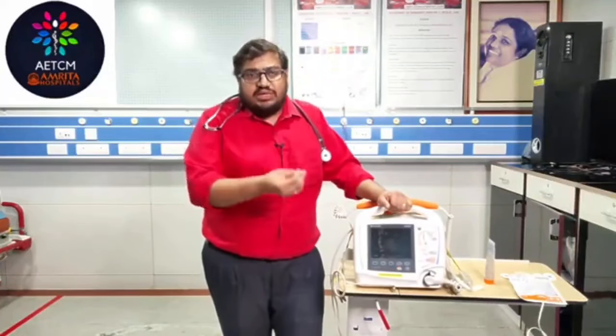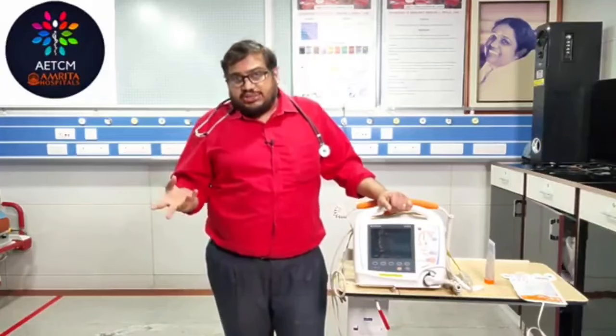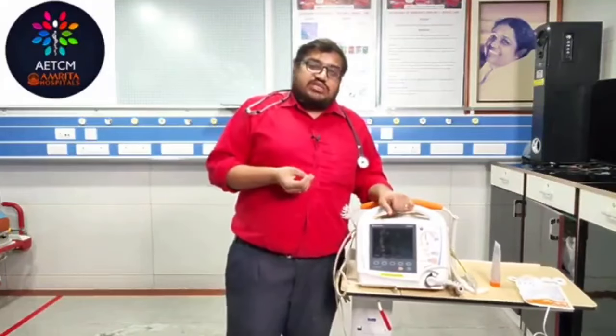First of all, what are the requirements for a cardioversion? For any procedure, you need to have a consent. You need to tell the family and bystander, and take consent, that I am going to deliver a shock, maybe we need to sedate him. There is a high chance that he can go into a cardiac arrest also. If you are not treating, he can go into an arrhythmia and cardiac arrest. But this is again a painful procedure. You need to explain this to the patient, and proper procedural sedation is needed.